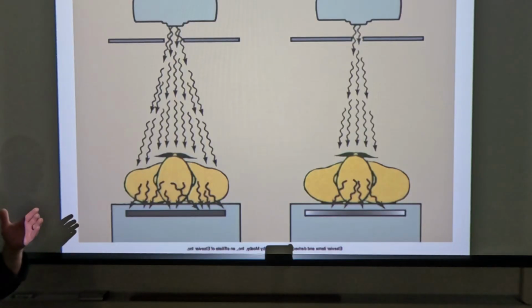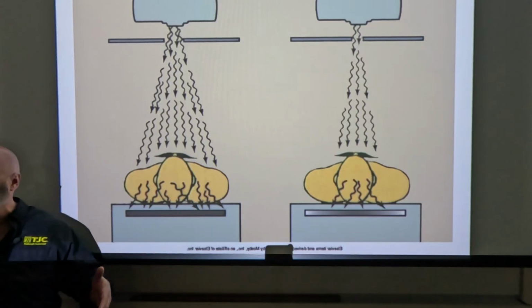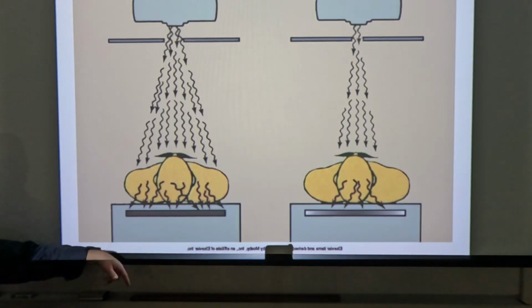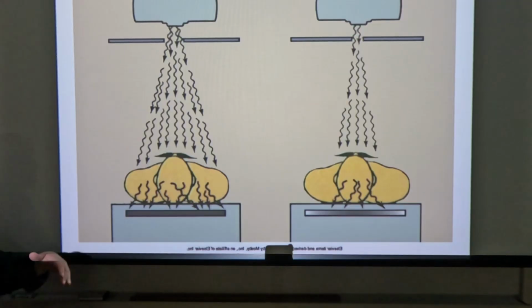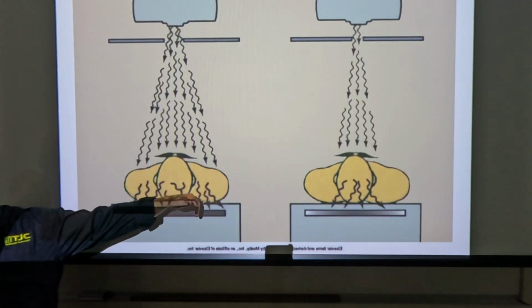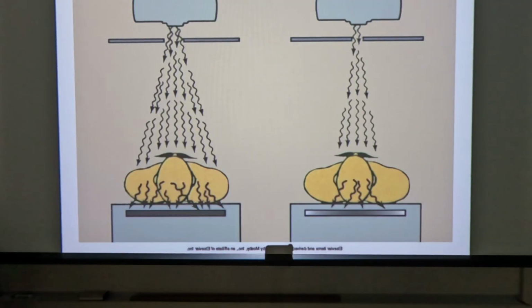Overexposure and direct exposure to the image receptor can actually give you a change in your contrast and density and appearance of your image. So, collimation is important. Collimation to prevent direct exposure to the image receptor is important for imaging. Collimation to prevent overexposure to the patient is really your ethical obligation, right? So, do it.